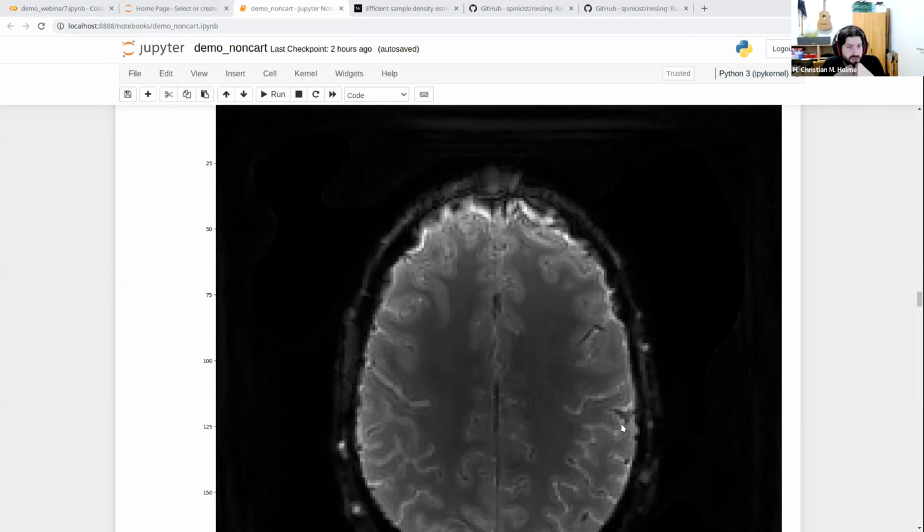We are more interested in fast imaging, so we are mostly doing 2D or maybe stack of stars. We haven't really done any Cartesian 3D or 3D spiral imaging ourselves. So that might be an issue, but we could work on that. And the last part is that you would need to generate a trajectory with the gradient delays corrected. And I'm certain that we do not have your 3D spiral implemented in BART right now.